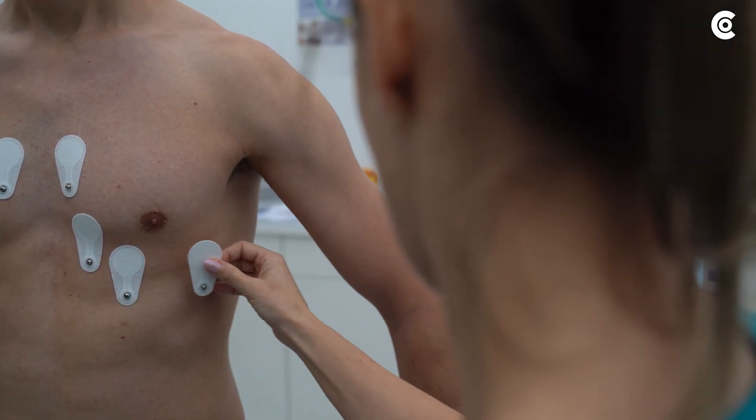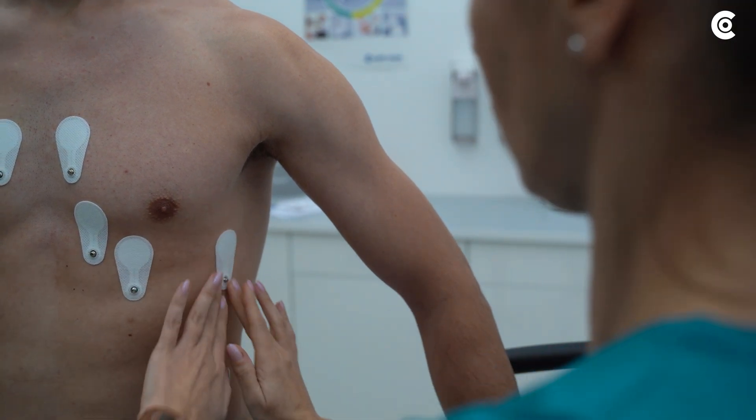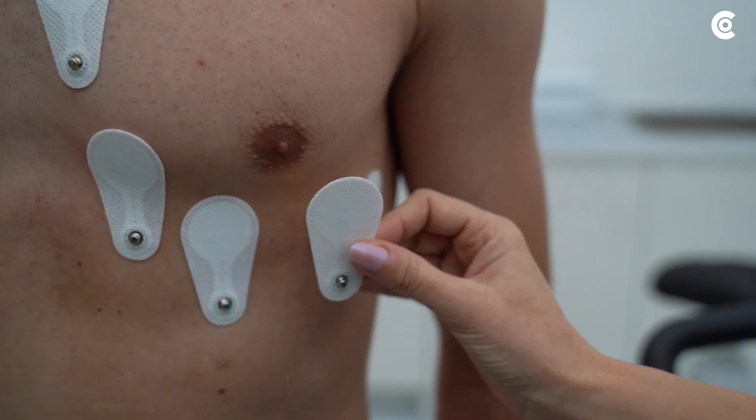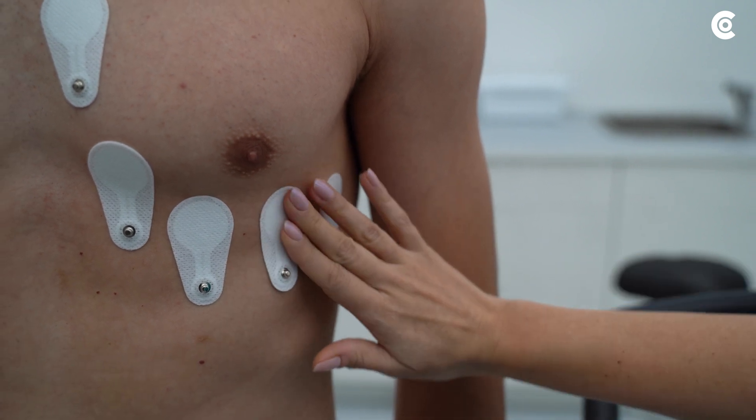C6 left on the mid-axillary line at the level of C4. And C5 left on the anterior axillary line, also at the level of C4.